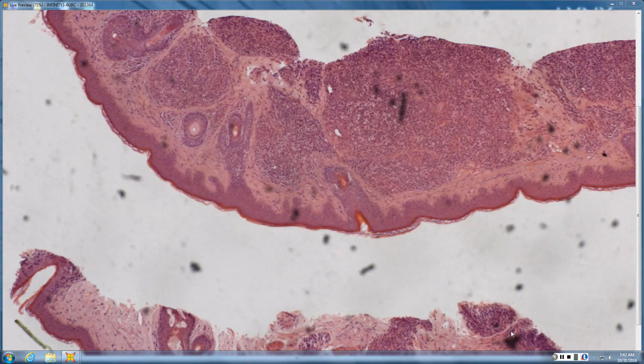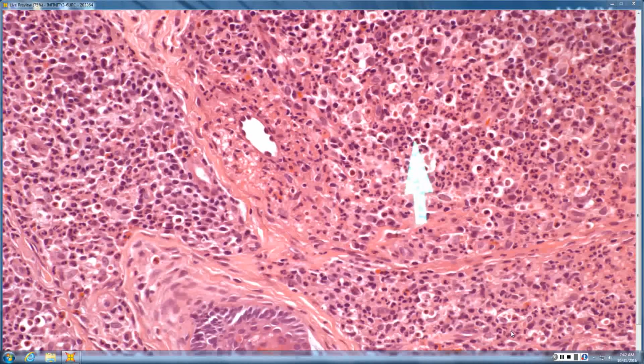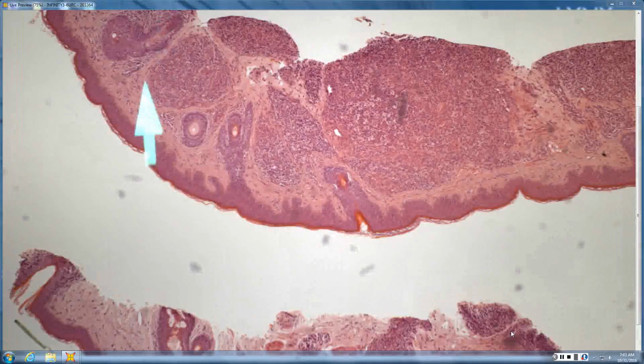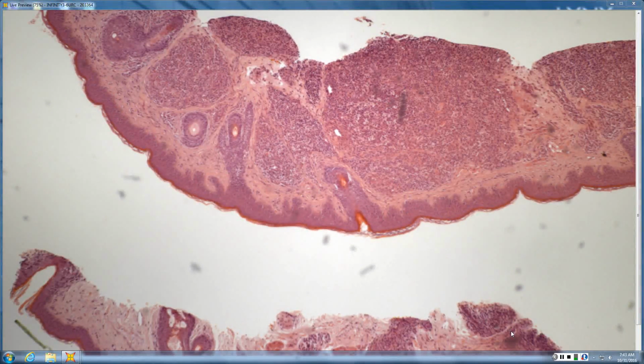Okay, so there are these very dense lymphoid aggregates again. There is a little bit of a Grenz zone. There's going to be vasculitis within here, I'm sure. You're pointing out some neutrophils. Yep. It looks like EED. So you have vasculitis, lots of neutrophils, few eosinophils, definite Grenz zone. If this were facial skin, you'd call it granuloma faciale.